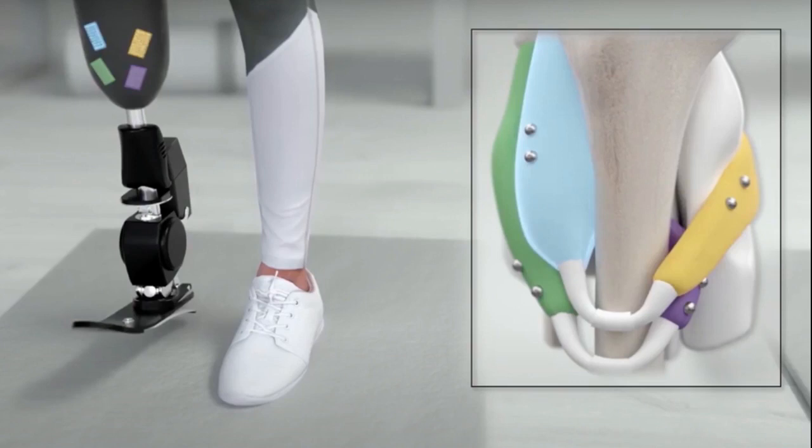The researchers are now planning to seek FDA approval to test the system in people with prosthetic limbs. They hope to use the sensor to control prostheses similar to the way surface EMG is used now. Measurements regarding the length of muscles will be fed into the control system of a prosthesis to help guide it to the position that the wearer intends. In addition to prosthetic limbs, those wearable robots could include robotic exoskeletons, which are worn outside the body to help people move their legs or arms more easily.